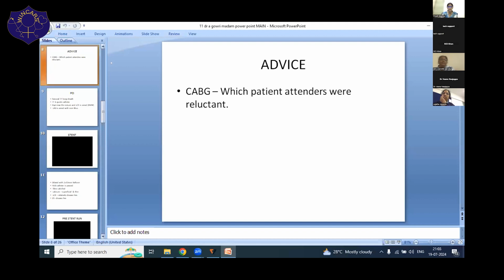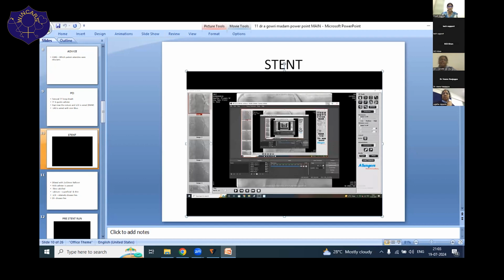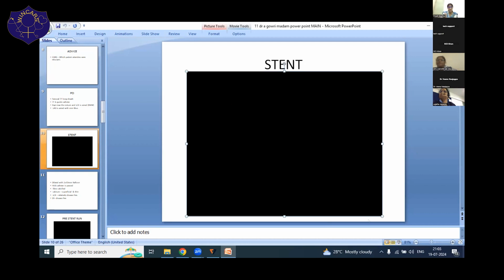Thank you, Dr. Gauri, for sharing your case, and it is commendable that you took this left main case. I would say imaging gives you the confidence of doing these cases. When you see the results are optimal, you can have a good night's sleep and you're not scared that in the midnight the patient will have some stent thrombosis or some slow flow or no-reflow. Because you are seeing it, you are fixing it, you are taking help of imaging.